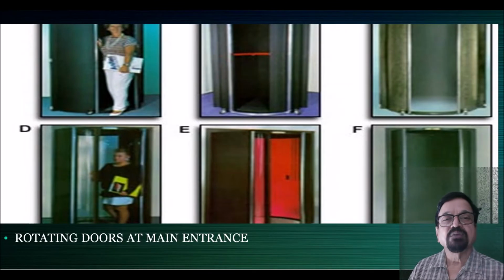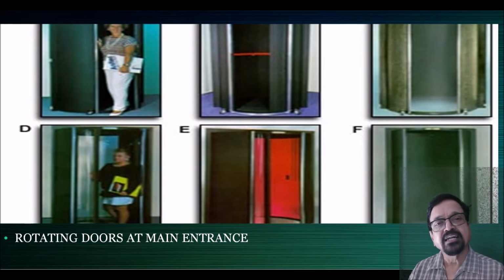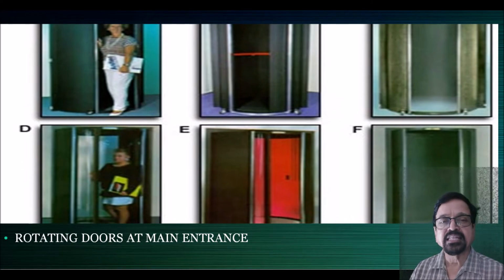Now, one thing I told you was a pass box by which a cassette can be put inside. The second method is that a technician carries the film along with him into the darkroom itself. Here we are shown a gate which is something like a C-shaped gate, which can open outside.